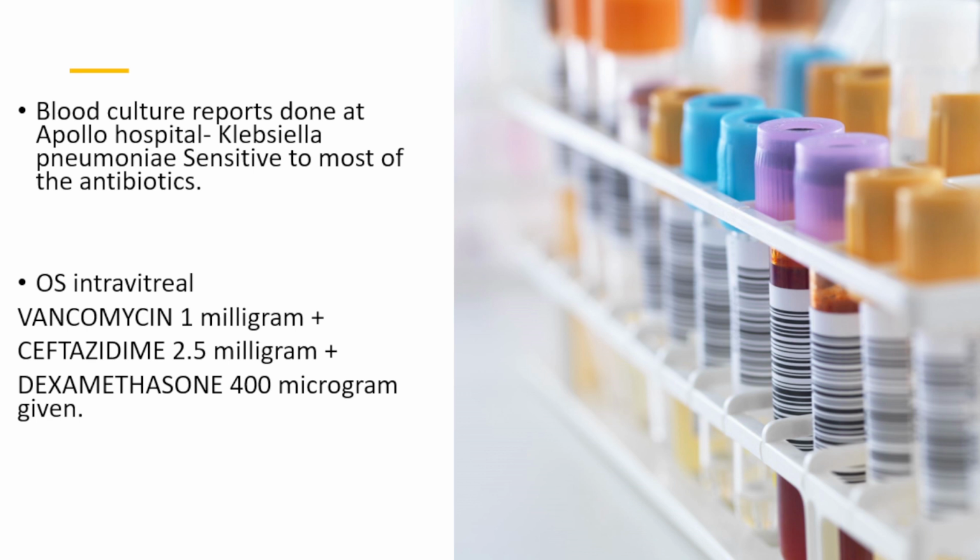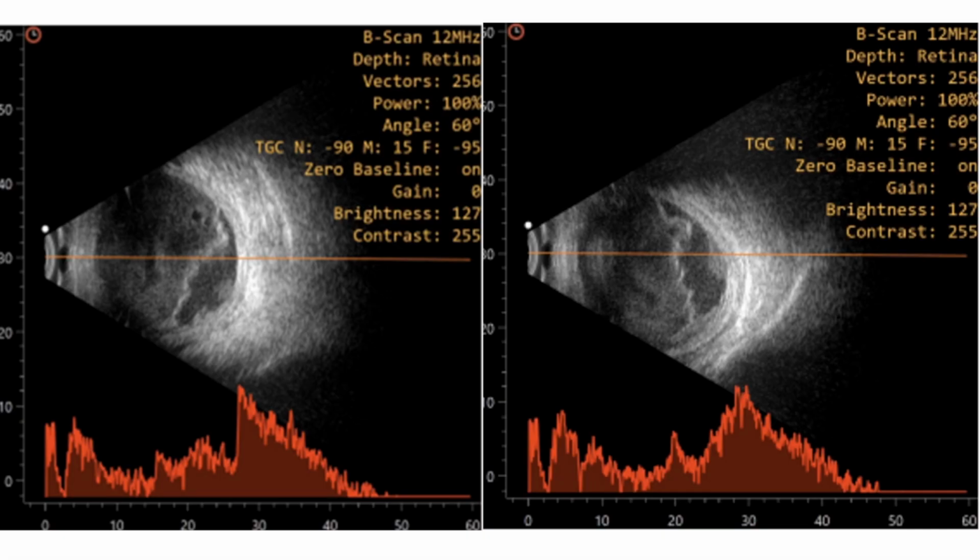Devika, what is the mobility of the membrane? You told moderate reflective. Yes, sir. The membranous echoes were non-mobile on mobility and were not persisting in low gain. They were not mobile. Okay. Attachments? Was it attached to the optic nerve? Attached to the optic nerve. Yes. So then what's your diagnosis? What is that membrane? So it could be incomplete PVD, because it was not attached.